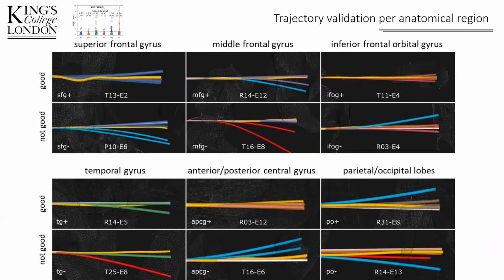And to illustrate trajectory inference of specific regions, we plot the rigid trajectory in white and the ground truth in yellow along the predictions of each fold, with colors corresponding to those used in the plot. If predicted trajectories have an MSE above 1 millimeter and bend in the direction of the ground truth, we color them in blue, indicating that predictions were overestimated.